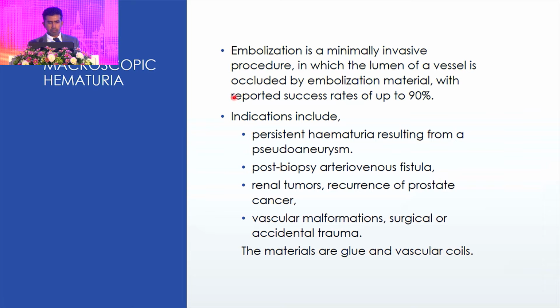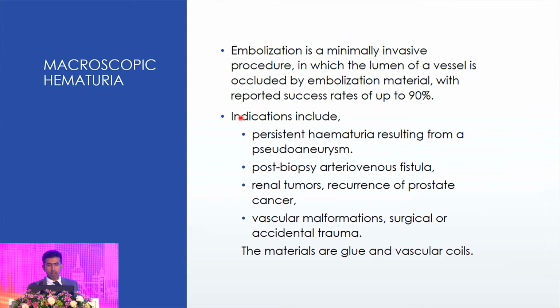Macroscopic hematuria. Embolization is a minimally invasive procedure in which the lumen of a vessel is occluded by embolization material, with reported success rates of up to 90%. Indications include persistent hematuria resulting from a pseudoaneurysm, post-biopsy arteriovenous fistulas, renal tumors and recurrence of prostate cancer, vascular malformations, surgical or accidental trauma. The materials we use are usually glue and vascular coils.